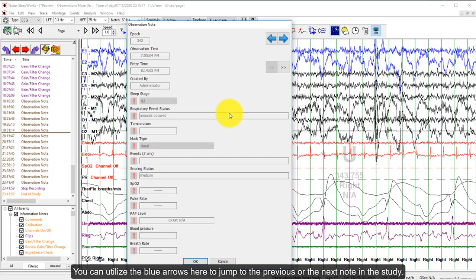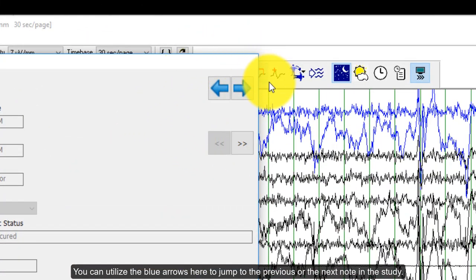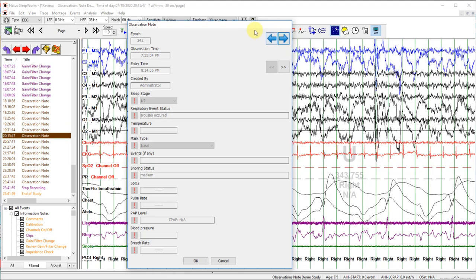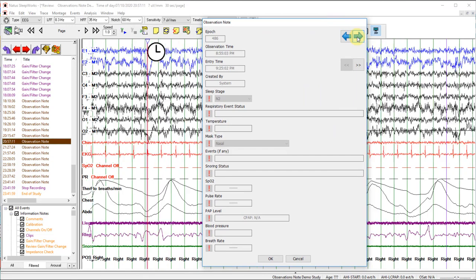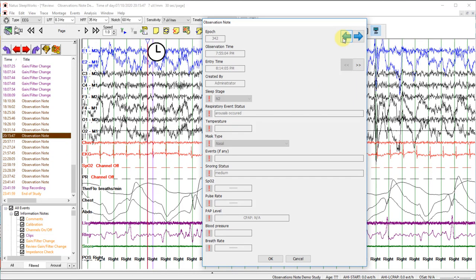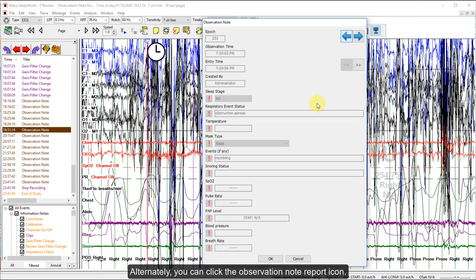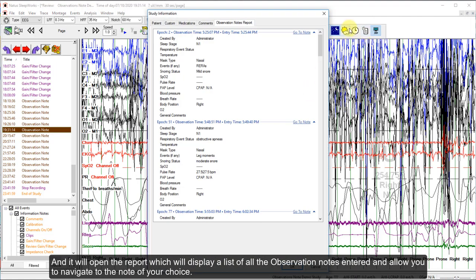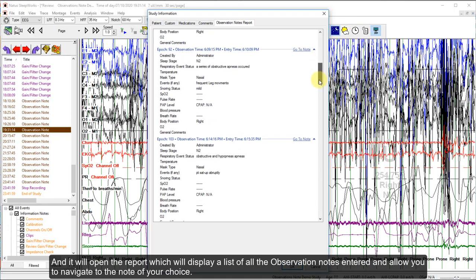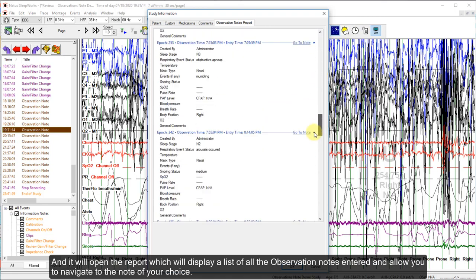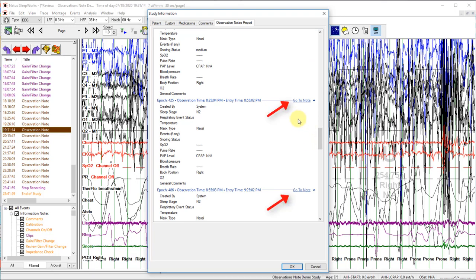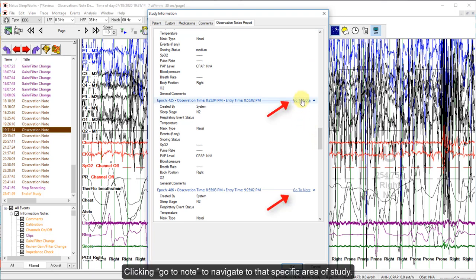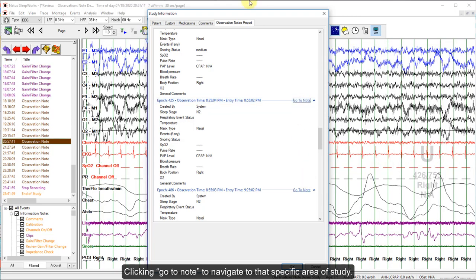You can utilize the blue arrows to jump to the previous node or the next node in the study. Alternatively, you can click on the observation node report icon, which will open the report displaying a list of all the observation nodes entered and allow you to navigate to the node of your choice by clicking 'Go to Node' to navigate to that specific area of the study.